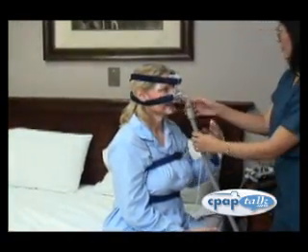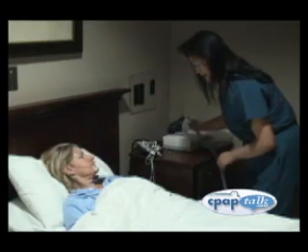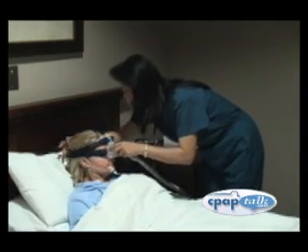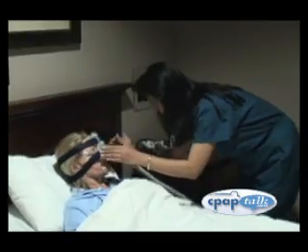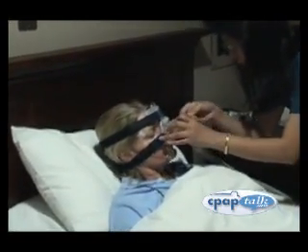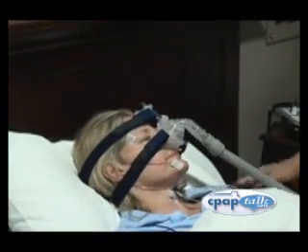If the presence of obstructive sleep apnea is found and documented during the night, the technician may re-enter your room and help you to put on a CPAP mask, which is attached to a CPAP machine. Once you fall asleep again, your technician will wait for you to enter a deep sleep, then gradually increase the pressure the CPAP uses to hold the airway open. The CPAP can end the struggle to breathe during deep sleep, allowing the user to get the sleep and air they need.